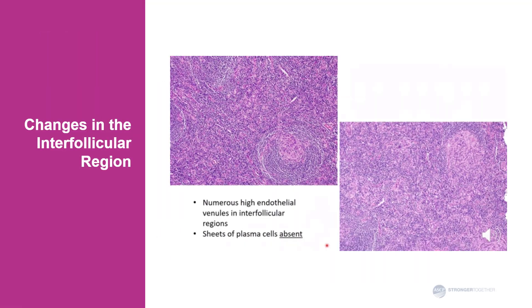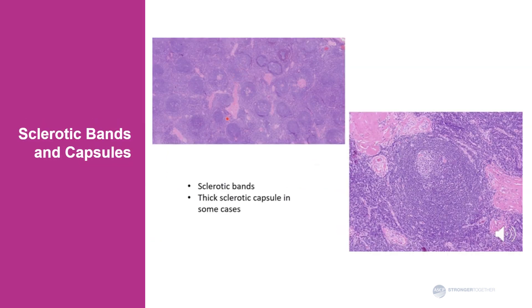Not only follicles show changes — prominent changes are also seen in the interfollicular region, the region in between the follicles. The most conspicuous is the marked increase in vascularity, and the vessels that proliferate are called high endothelial venules. An important pertinent negative is that the sheets of plasma cells typically seen in the plasma cell variant of Castleman disease are absent in the hyaline vascular variant. Some cases also show sclerotic bands, as demonstrated here — these pink structures are sclerotic bands.